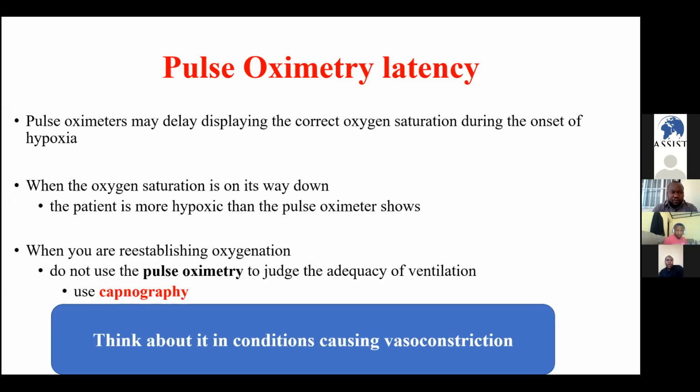intubating your patient and you see on the monitor or the screen that the patient is desaturating. So it may be a false perception, concluding that maybe you have misplaced the endotracheal tube and extubating the patient, while the pulse oximeter has been delayed in picking up the real signal to give the number for the saturation.